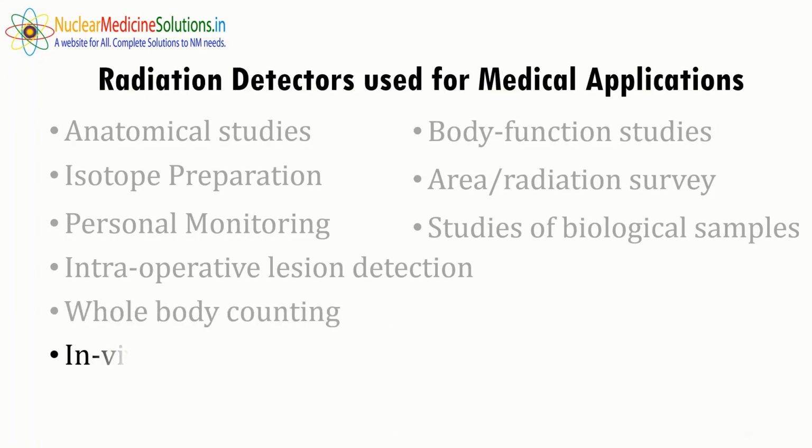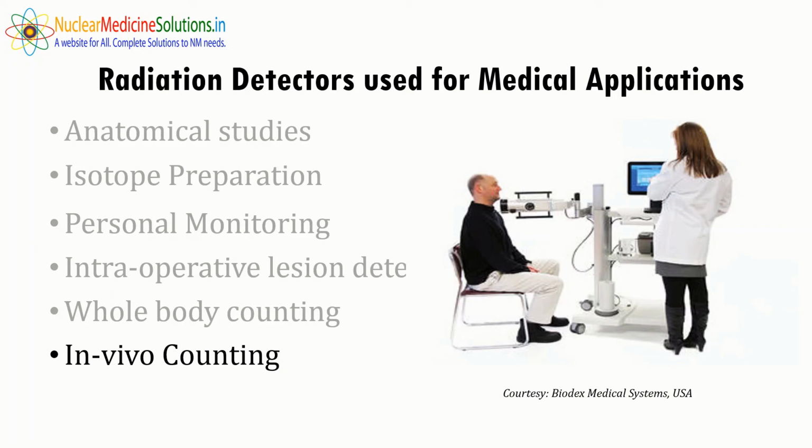In vivo counting, like thyroid uptake studies, is carried out where the radioactive concentration of iodine is measured in the thyroid gland, and based on these measurements treatment is planned or a diagnostic decision is reached.